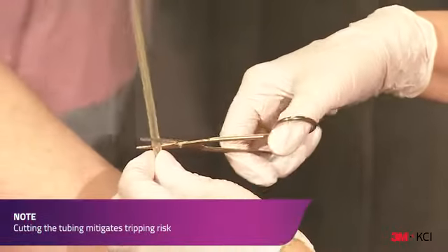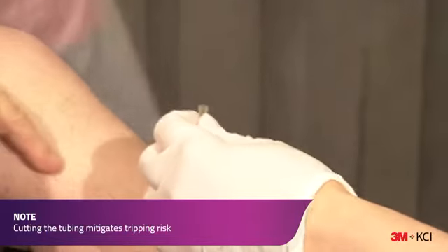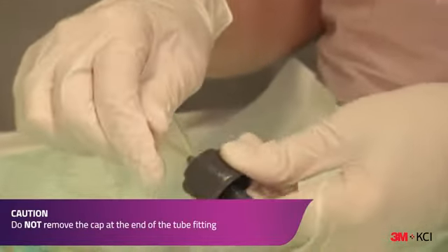Cut the tubing to the desired length, ensuring the cut is straight and not at an angle. Fully insert the tube fitting onto the tubing.